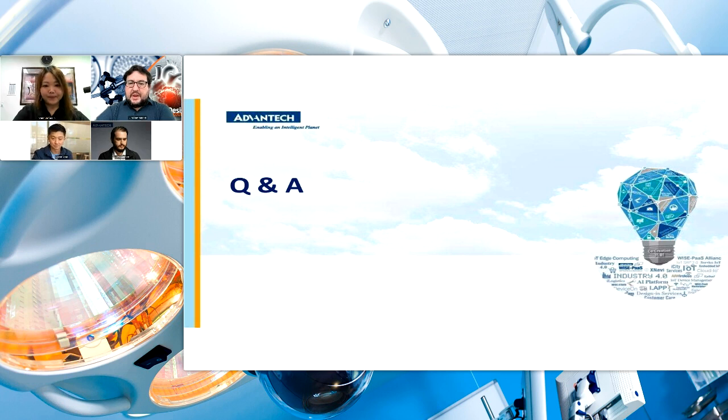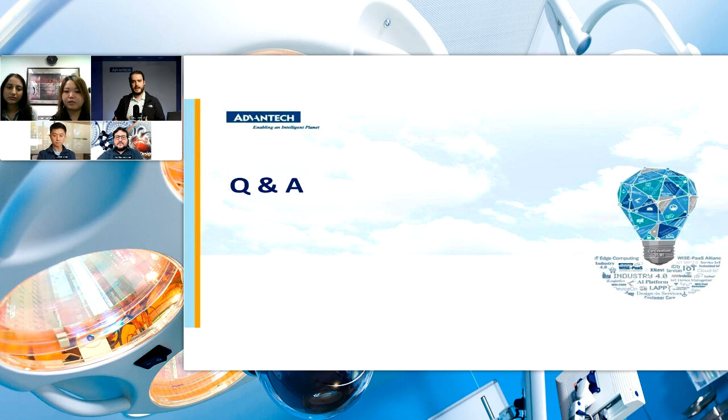Okay. And then we've got a question here about, are any of these SOMs radiation hardened? That's a good question. As far as radiation hardening on the system on module products, it depends on which degree of radiation hardening you're looking for. Especially in the medical imaging space, we do a lot to manage the EMI and the noise environment with the system on modules, to keep the image coming through nice and clean. But if you're looking more for radiation hardening in satellite applications, that's a little bit more advanced, but something that we could look into depending on the project.